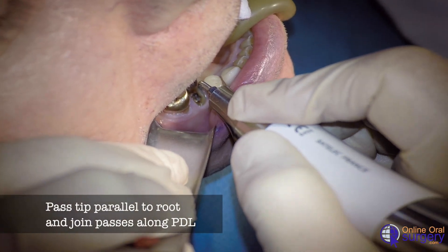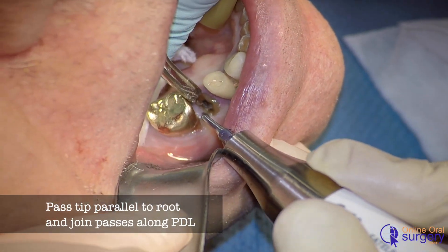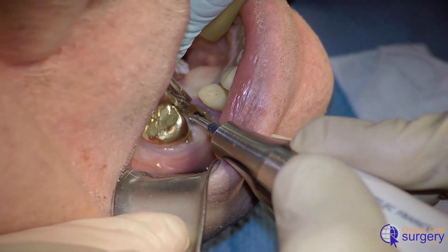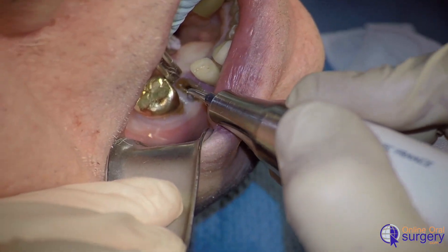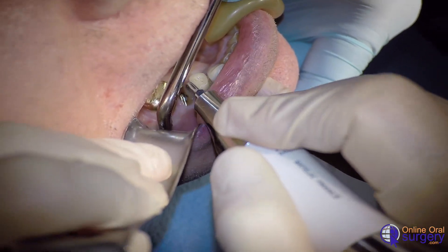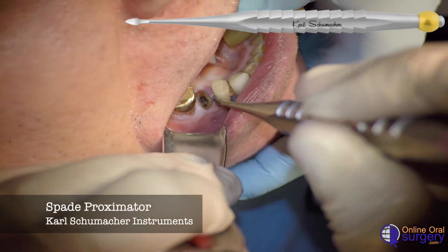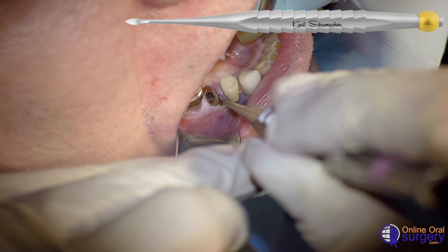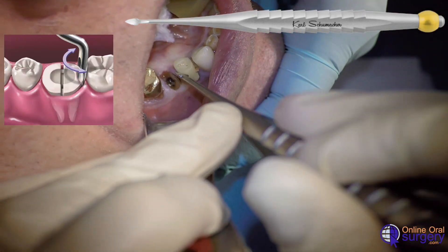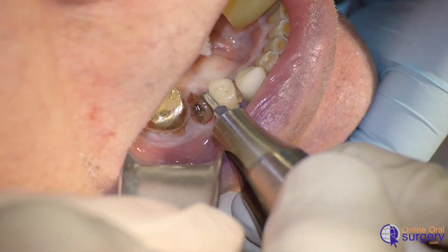Then I'm going to connect those cuts buccal-lingually, and do the same on the distal aspect of the root, so that each pass I'm going a little bit deeper along the root, a little further towards the apex, and then connecting those cuts. We can come in with our spade proximator from Karl Schumacher Instruments and use this to begin luxating the root within the alveolus by entering into the PDL space and giving it a rocking motion, trying to get it a little deeper.